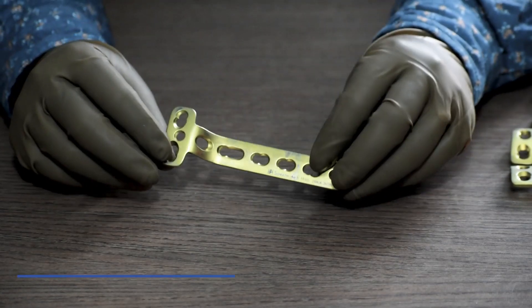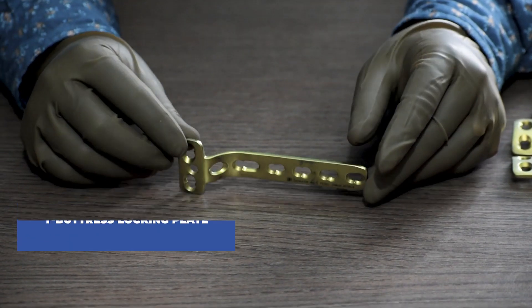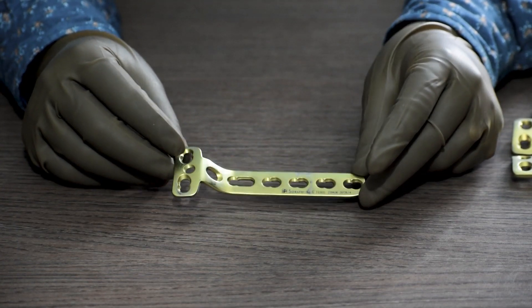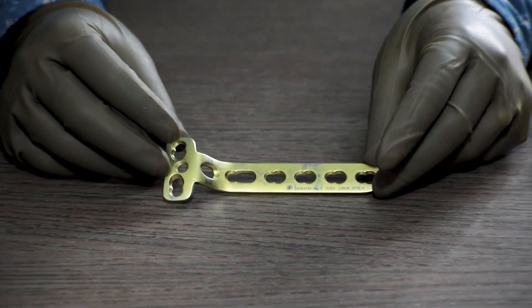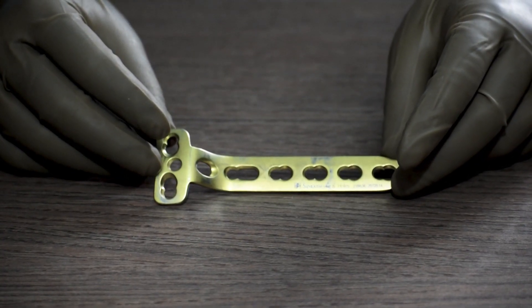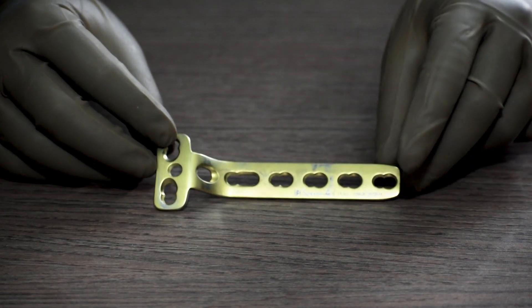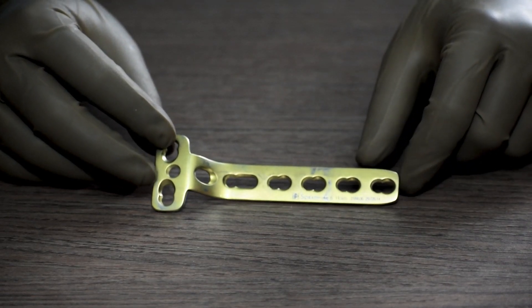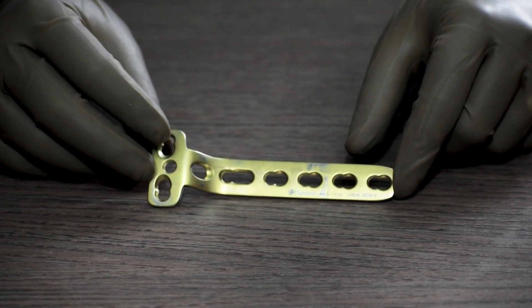Next is the T buttress locking plate. This is also a 4.5 system and is a universal plate — it is not side specific. It is available in different sizes starting from 4 holes till 10 holes with 2 holes gap in between: 4 holes, 6 holes, 8 holes, 10 holes.